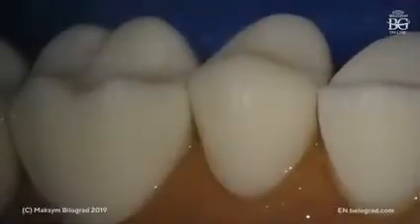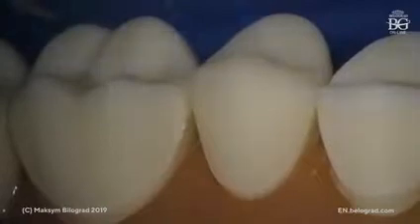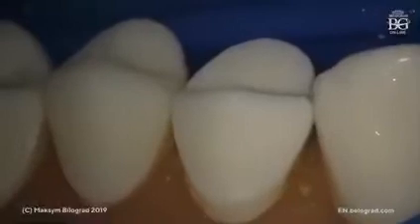Okay, it's done. Premolar is easier because it is closer to us, and also it is smaller than the molar tooth. And now let's go to this one. Same thing, we will move our finish line more down. We move the finish line more down, working with half of the burr, half tip, moving preparations more distal.